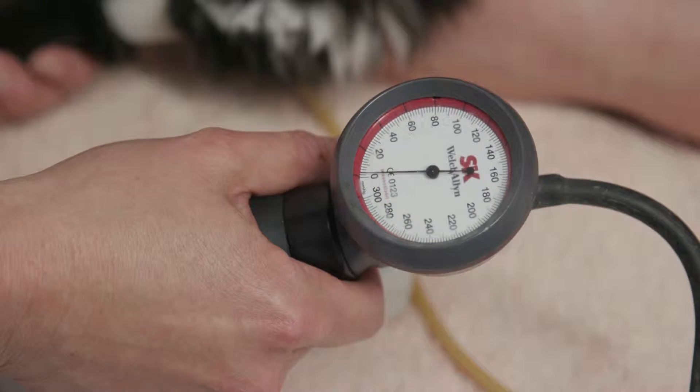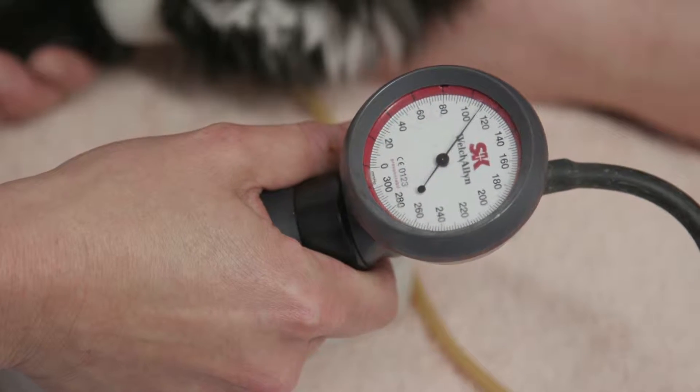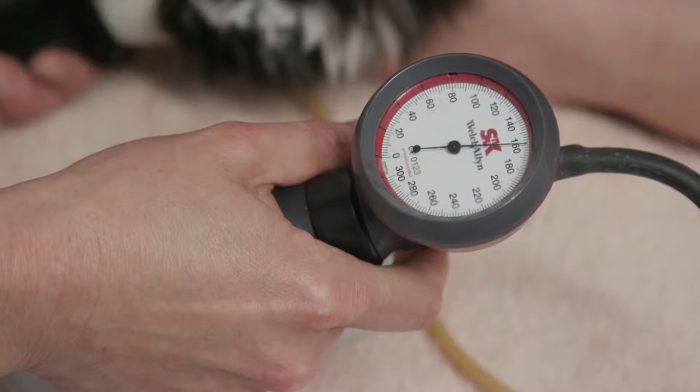Once we have a very good clear pulse signal, we can inflate the cuff. I suggest that you do this nice and gently in a stepwise fashion, and all the time look at that pressure gauge and note the point at which you can no longer hear that pulse signal.